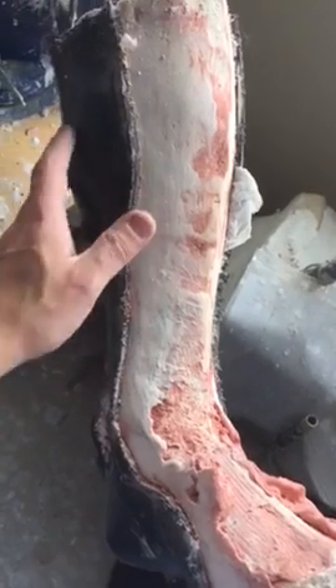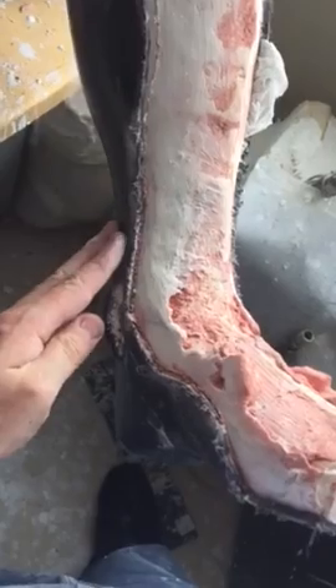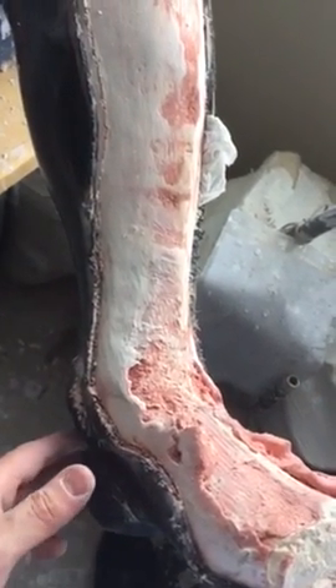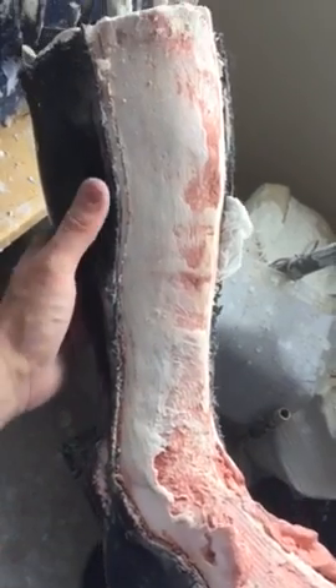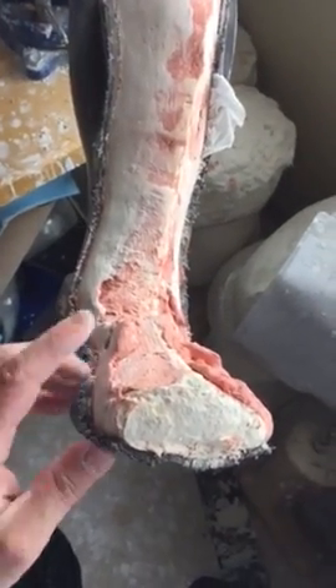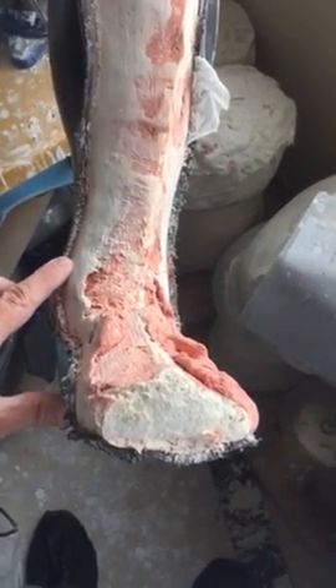We cut it so now I can take this off — the rest of the mold — the actual part that's going to be the brace. This is the next step. After this part right here, the next step would actually be taking the brace — as you can see, this edge is not smooth.